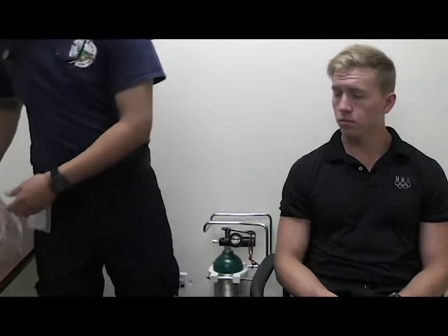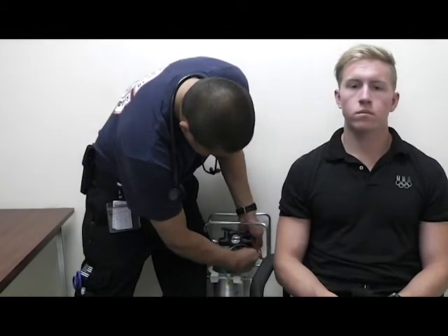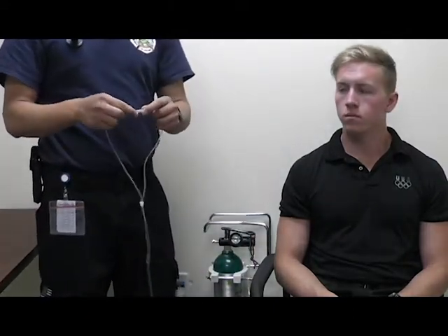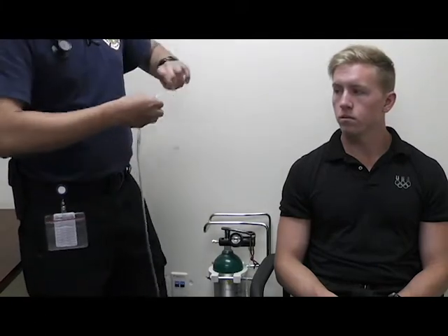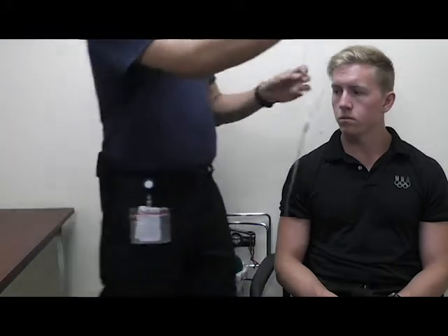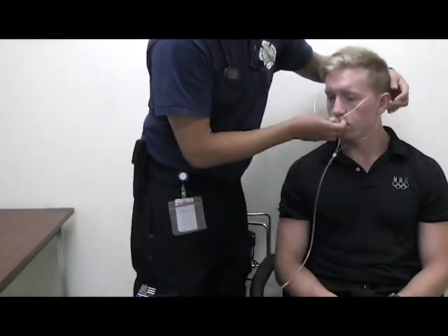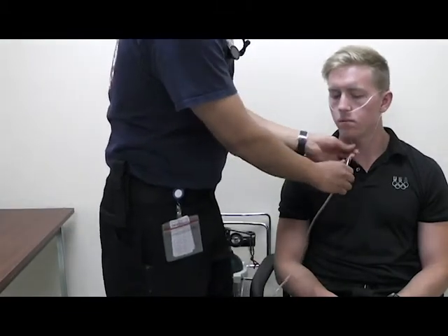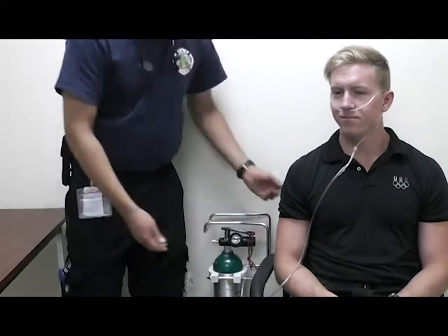First, for your nasal cannula, you're going to attach it to your O2 tank. Once that is attached, you have a little nose piece for your patient, and this is going to go around their neck. You're going to loosen it, place it over their ears, then place it in their nose and tighten it down. The flow rate you're going to adjust this to is about one to six liters per minute on oxygen.